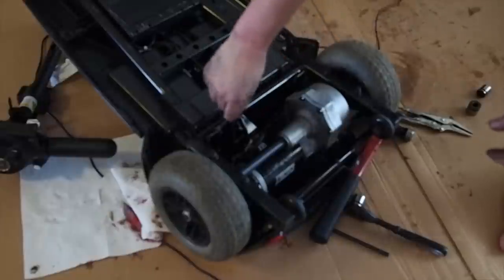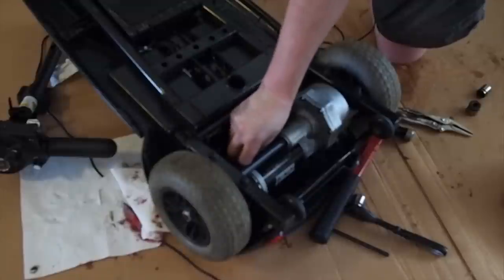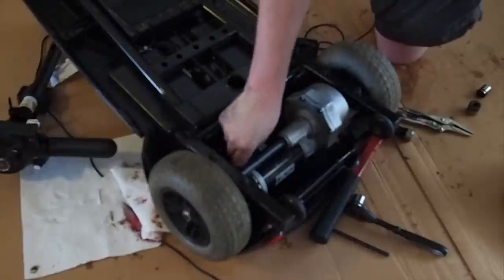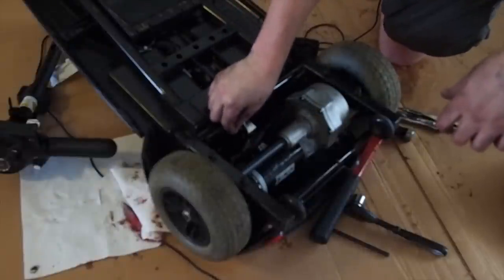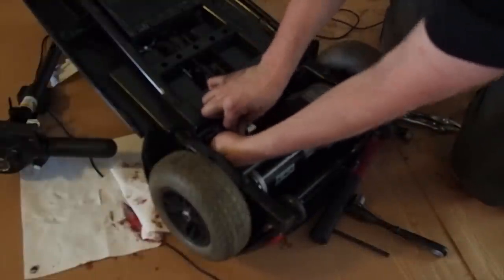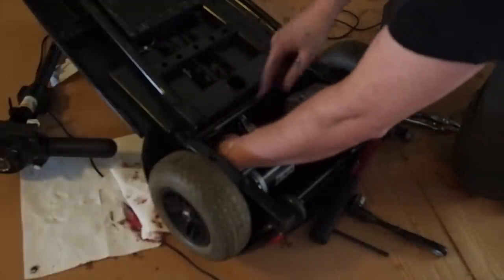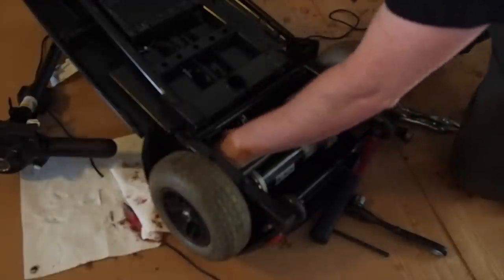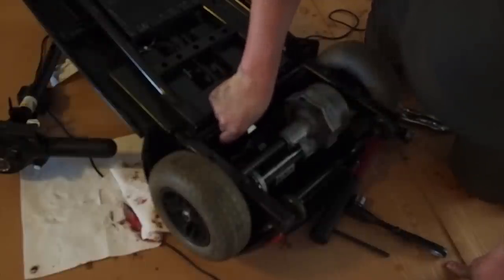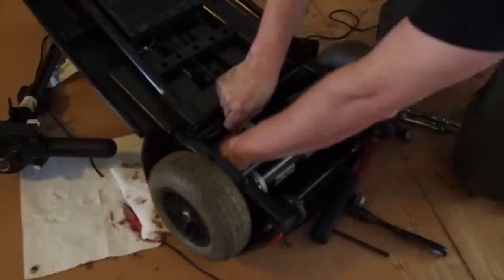Somebody's going to comment, and I know someone will, why didn't you put the wheels on last? And I understand, and that's what I should have done. Mostly I was concerned that the transaxle wasn't going to work, so I wanted to get the wheels on so I can test it. In truth though, even if it didn't work, it wouldn't have mattered because I'm not going to rebuild it. I mean, maybe I'll do it in a few weeks, but I'm not going to do it again today.